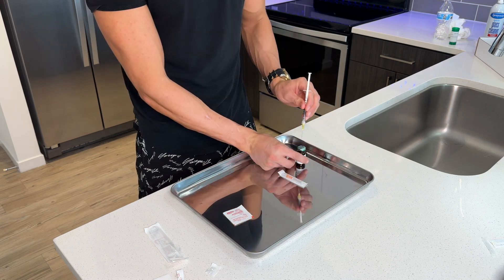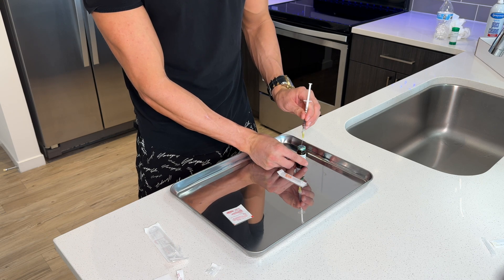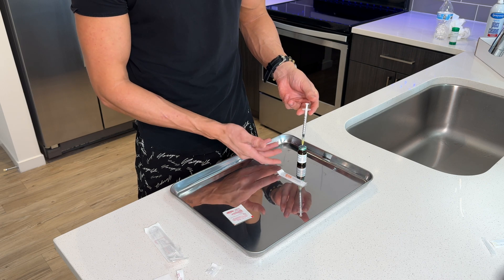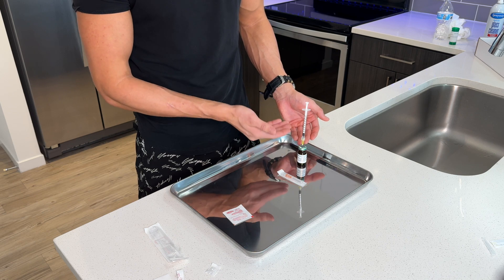Remove the cap from the needle. When putting the air into the vial, you're gonna wanna go from the top — don't flip the vial upside down yet. Go ahead, put in the needle, and plunge the air into the vial. Now the vial has completely equalized pressure and it's ready to have testosterone drawn out.